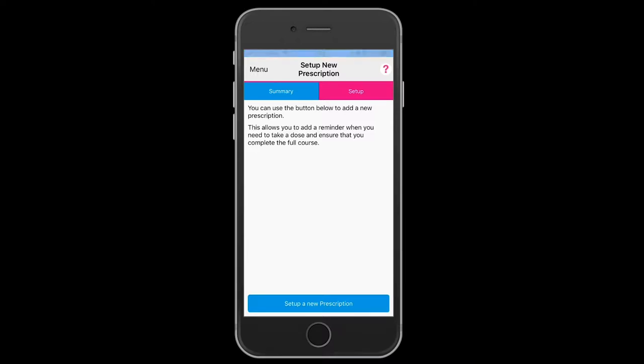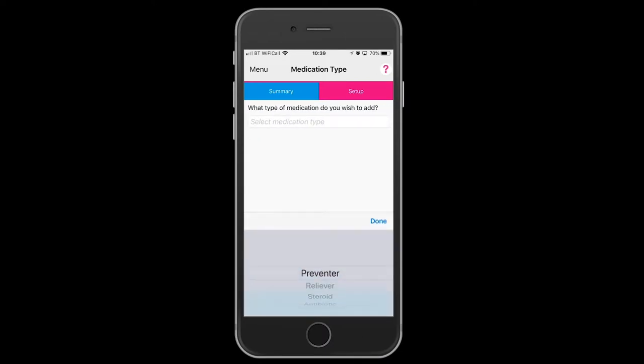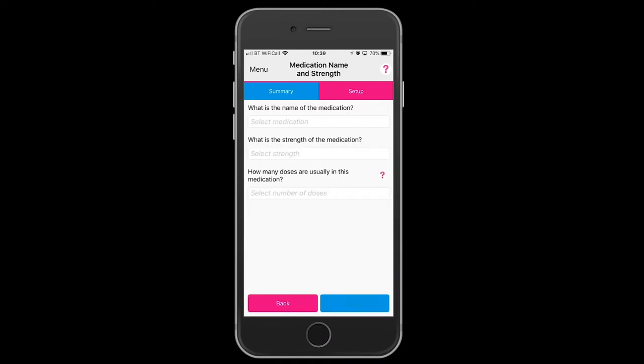Touching the blue tab down the bottom, you select the type of medication — we're going to use the preventer. And next.